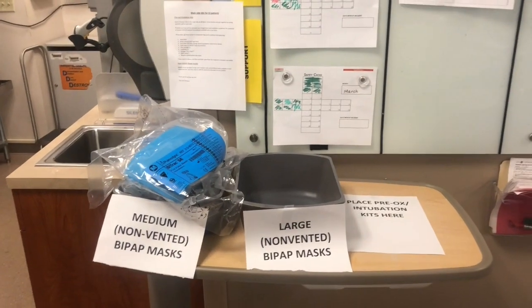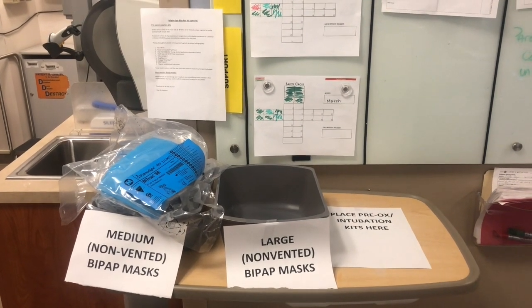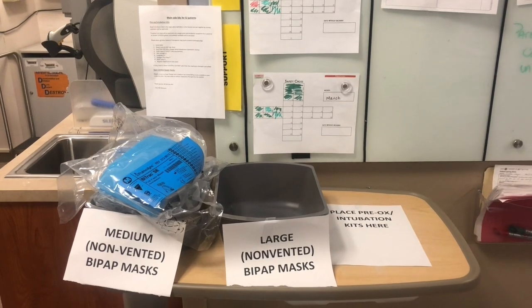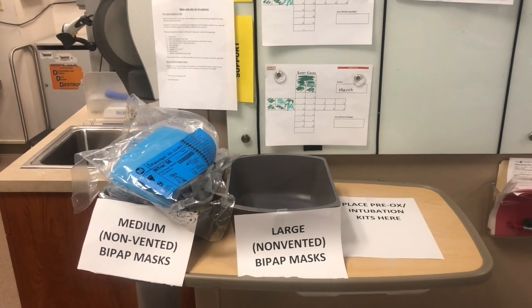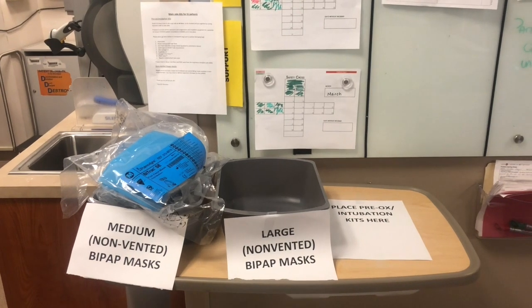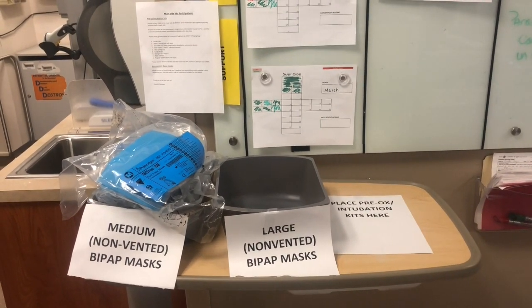So between the charge nurse desk and the B-side UC desk, that's going to be the area where we keep the BiPAP masks and the pre-ox kits on the main side, because there probably will be a couple of patients who slip through the triage cracks — ILI patients who go to the main side — who end up needing to be intubated or oxygenated with non-rebreather level oxygen.